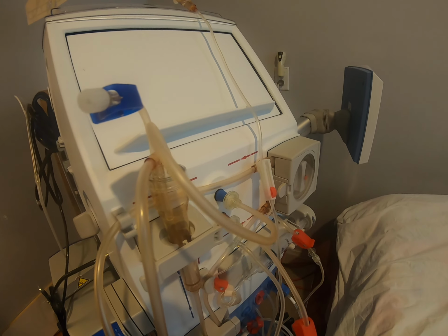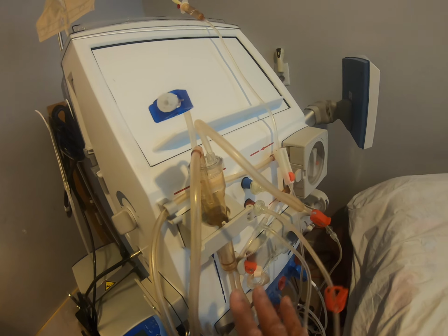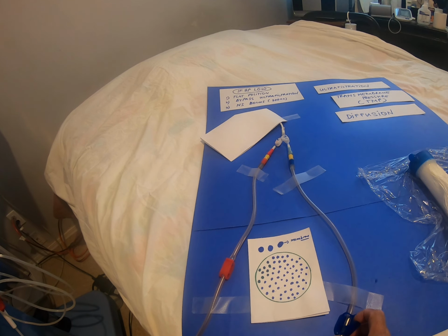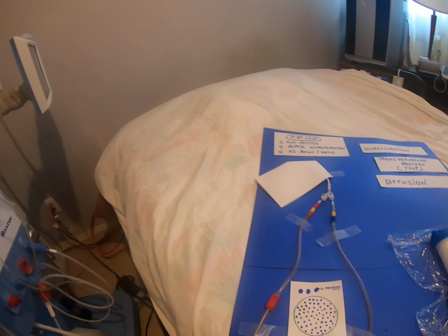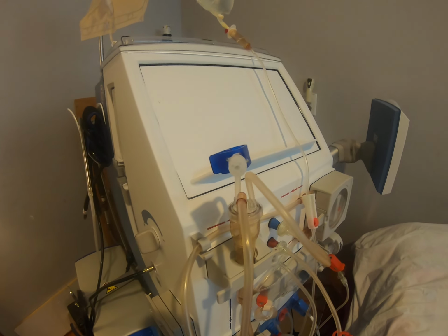What you see first going into the patient is the blood. The blood from the tubing will return to the patient via the venous line. We have about maybe 350, 400 cc of blood going back to the patient. It's like 1 unit of blood. And when the tubings are cleared, here comes the bolus of normal saline, which is about 300 cc.